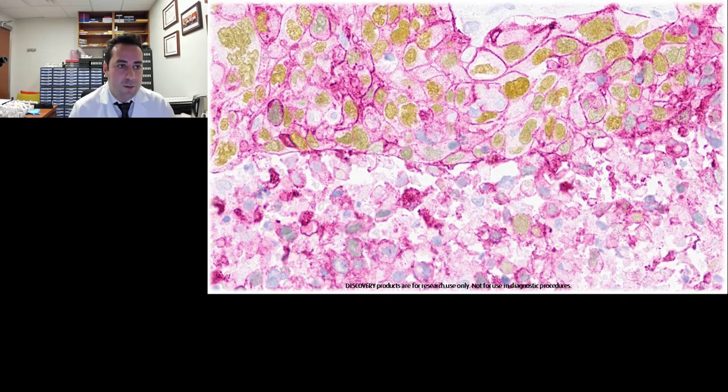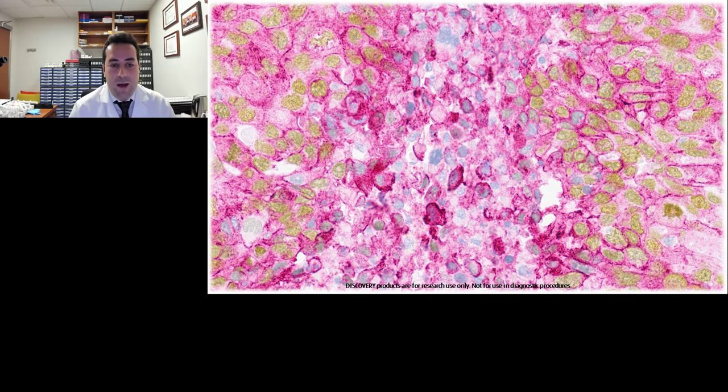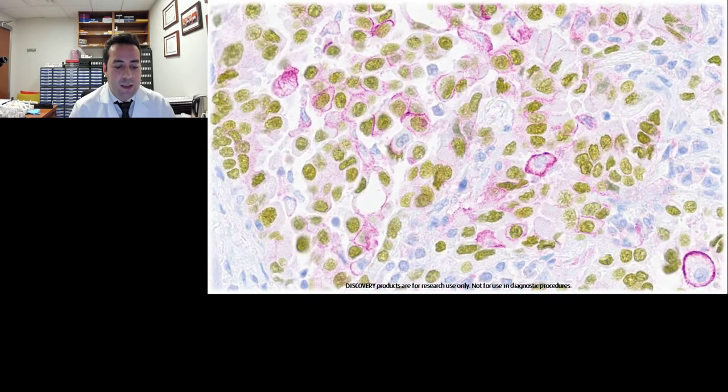Similar to this image, in this one, there is an area of macrophages in the center of the image, which can easily be identified as PD-L1 positive tumor cells on monostain. And this is another case showing a smaller percentage of PD-L1 positivity. And as you can see, the staining intensity is variable from weak to strong in this sample.